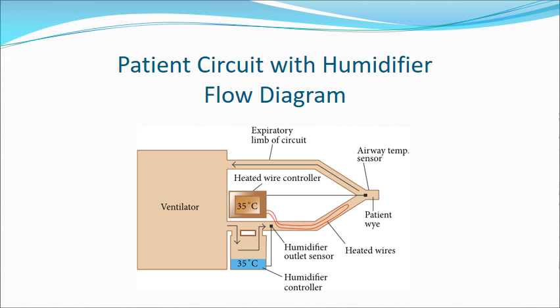You do not want moist air going into an oxygen analyzer. In a chemical analyzer, you can actually damage the analyzer itself. In the ultrasonic one, it won't damage the chamber, but it will introduce moisture, which will have to be dried out, and it will also give you an incorrect reading. And it's equally important to realize that if you have a humidifier on an oxygen concentrator, you do not want any moisture introduced before you're measuring the oxygen output of that oxygen concentrator.